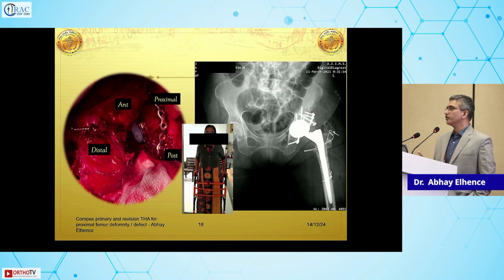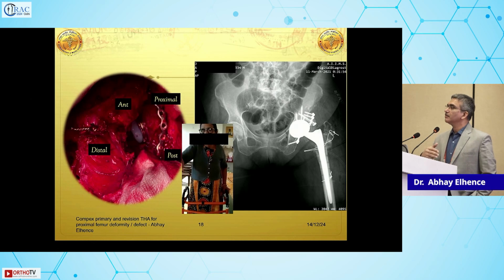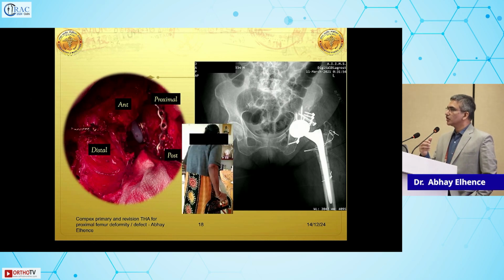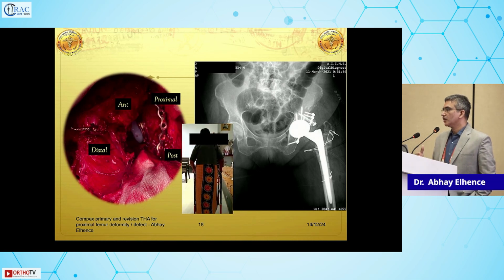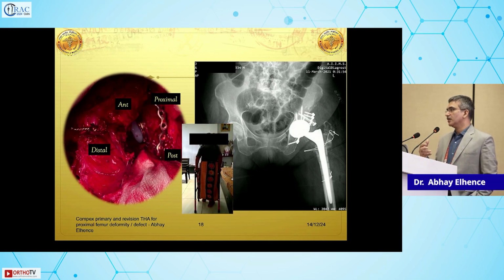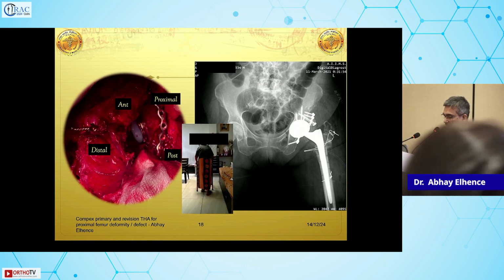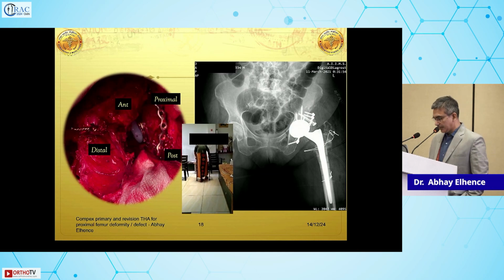You need a diaphyseal fixing stem because the abductor is not so great, because the proximal femur is ectatic, and that is where your proximal femur fixation will not hold, and you need something on the distal diaphysis or the isthmus which will give you a perfectly balanced stem. In addition, if you've got abductor insufficiency, go in for a dual mobility.